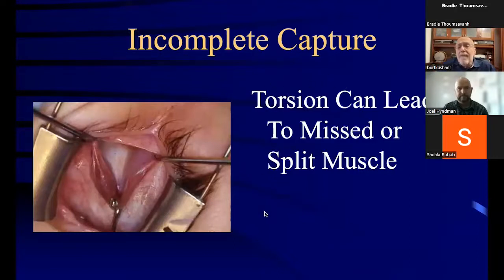Now, if you have an overacting inferior oblique, presumably you have that, or you wouldn't be operating on it in most cases. The eye is excyclorotated, and that alters our anatomy. And if the eye is excyclorotated, the lateral rectus muscle will be down closer to the inferior temporal quadrant where the inferior oblique is, and the inferior oblique is closer to where the inferior rectus is.